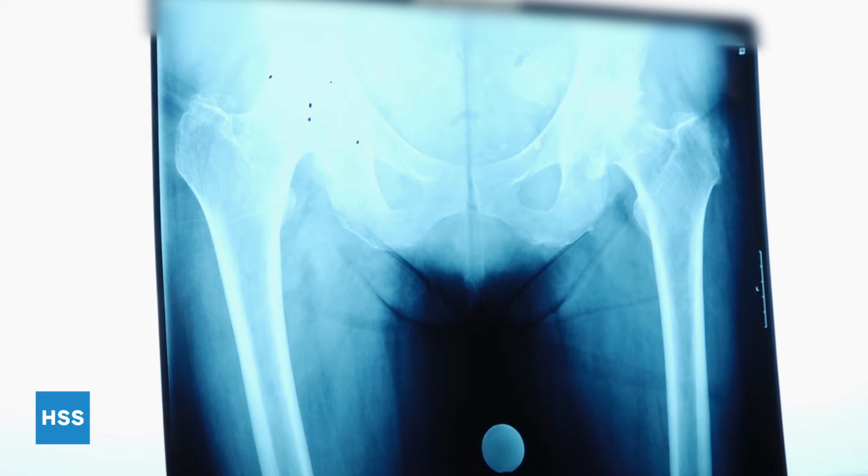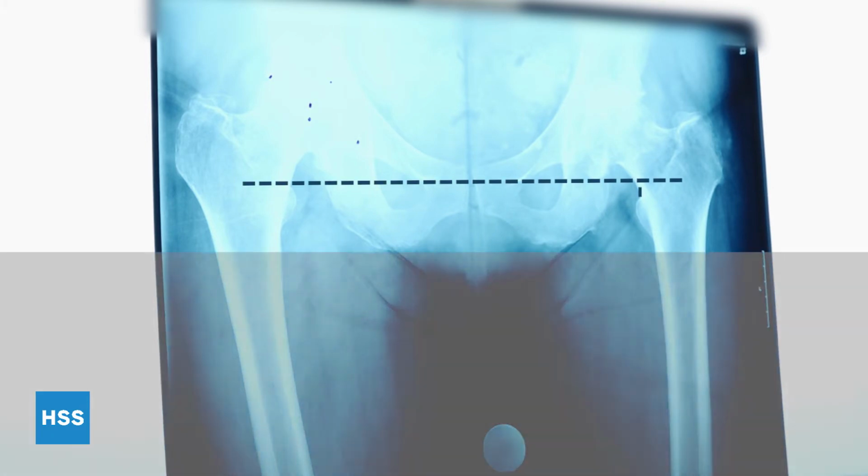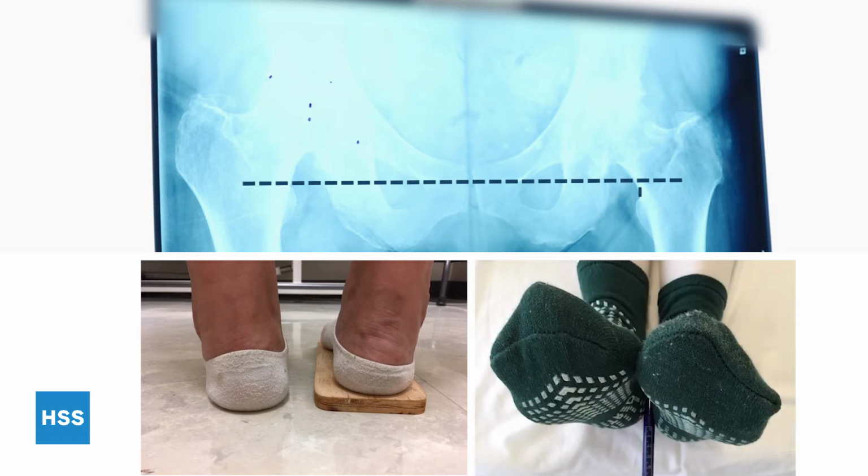On the AP radiograph, the horizontal line should be parallel to the bottom of the teardrops. The clinical leg length discrepancy is based on the patient's subjective perception of being even with a block under the shorter foot. I find it useful to triple check the clinical and radiographic measurements in the holding area while the patient is lying down supine, straight, assessing the heel level with the ankles dorsiflexed.